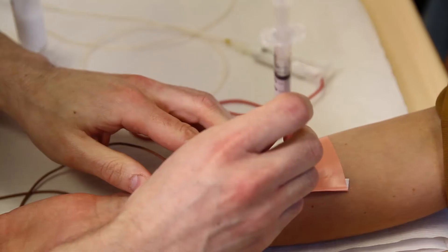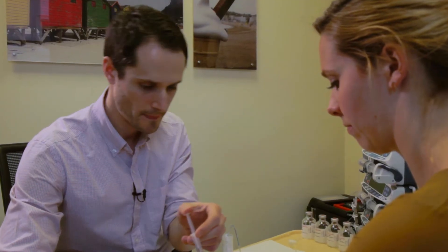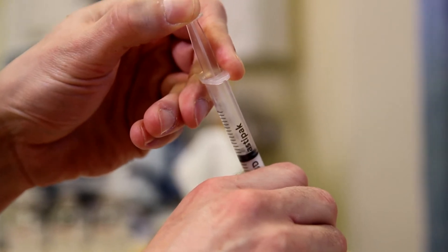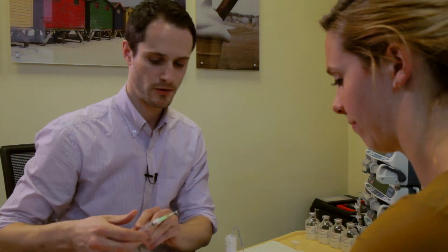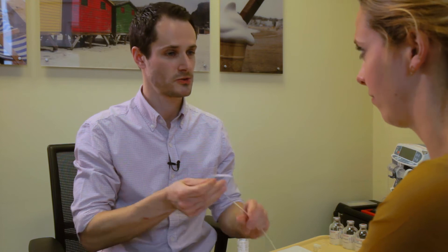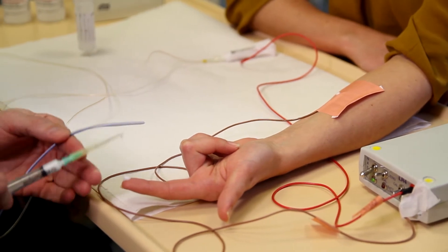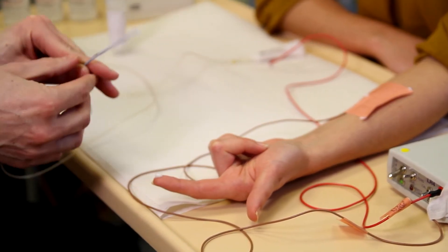I'm just going to put some more cream in here which increases the conduction between the skin and the electrode. This cream has special conduction properties, so I'm going to fill the well underneath the electrode with the cream. I'm just going to check we have a connection, so let me check the skin potential. If you give me your finger, I'm just going to put some cream on the end of your finger, and this is to make sure that there is a viable circuit.